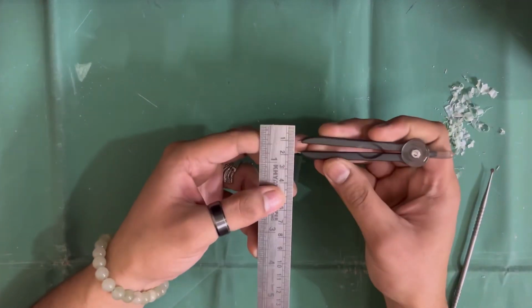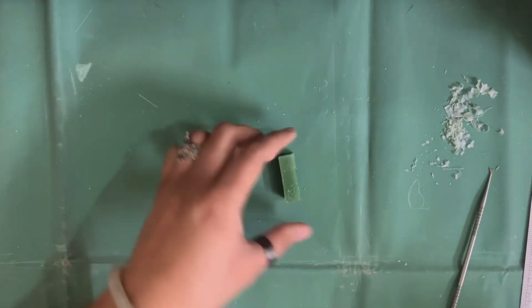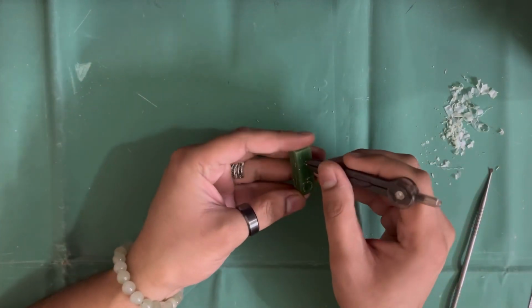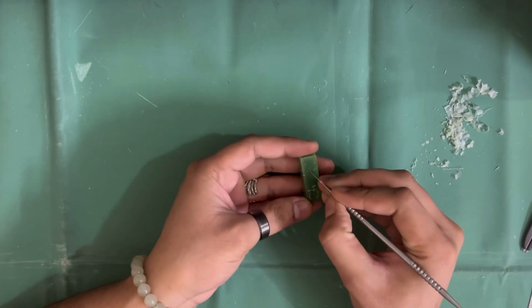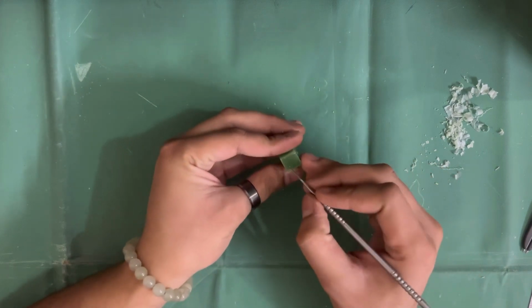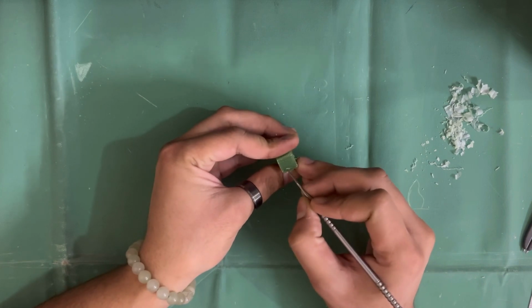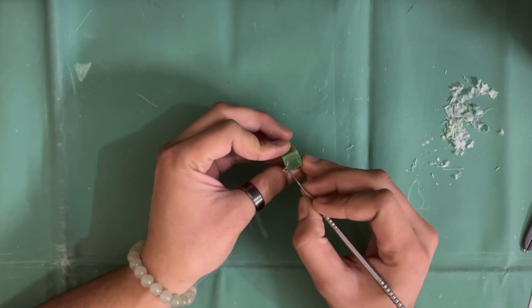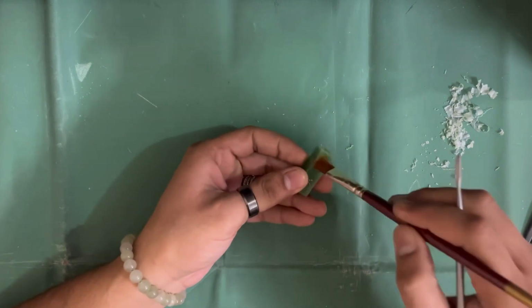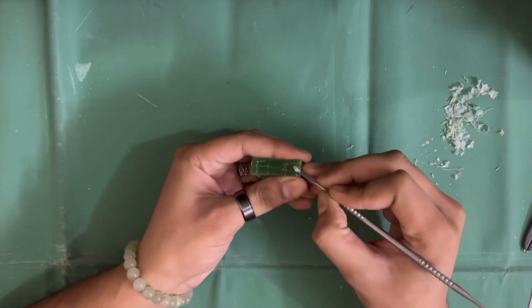Now we're gonna mark the curvature of the cervical line on the mesial surface, which is 3 mm, and on the distal surface, which is 2 mm. Now we are done with the marking of all aspects on the crown. We will join the lines on the top of the block, so that when we carve out, we'll still have some dimensions left and we don't need to measure again.